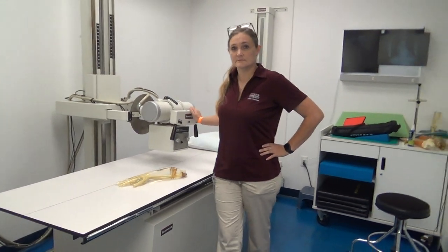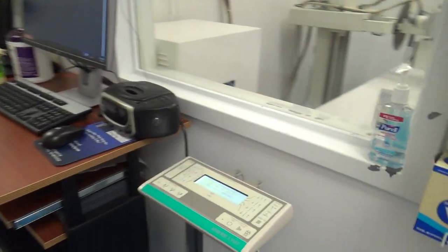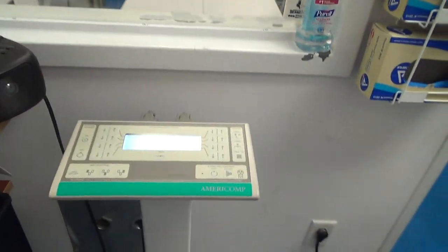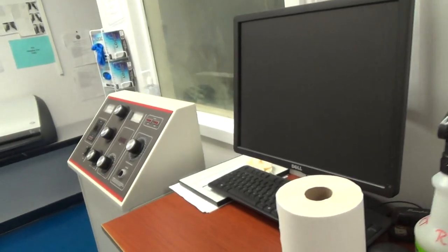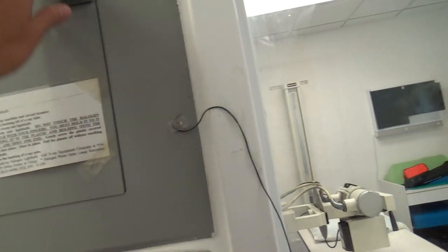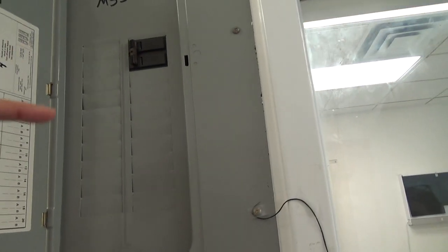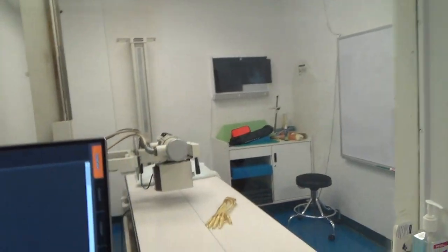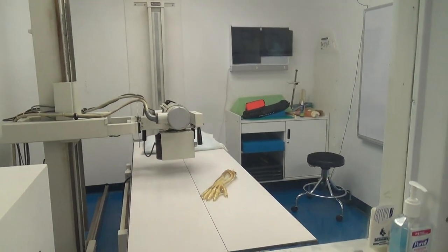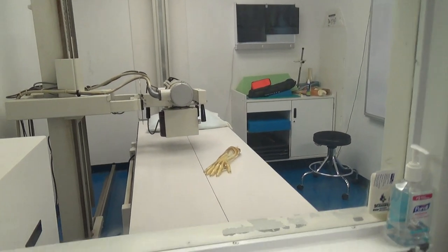So this is our digital side over here, and then this over here is our CR side. Up here is the panel where you actually have to turn it on. If you don't turn on the electricity, you won't be able to move the equipment properly.